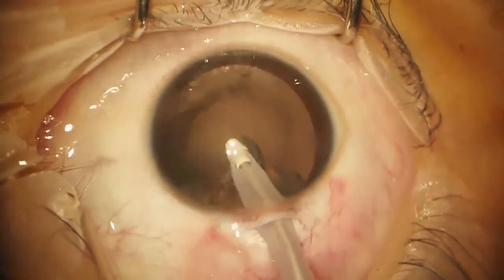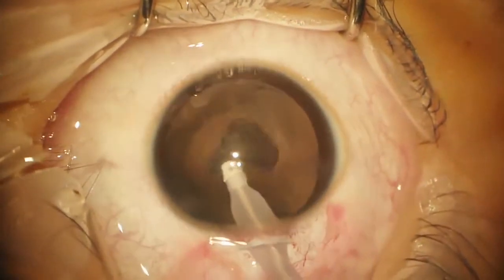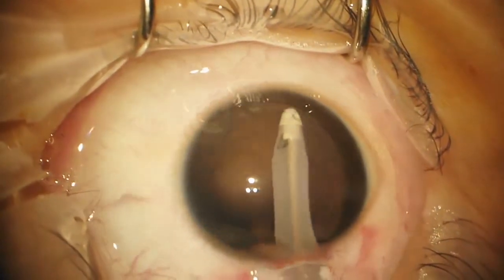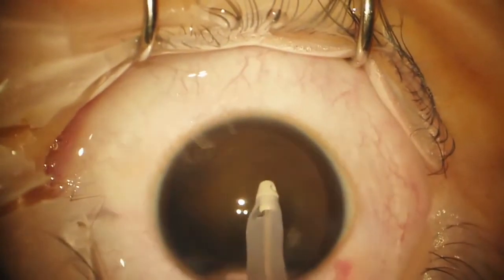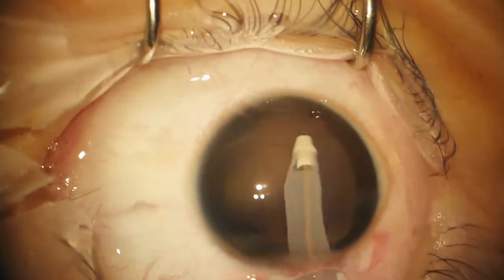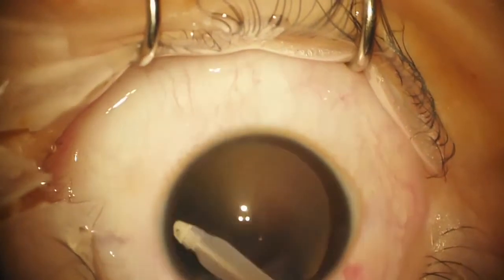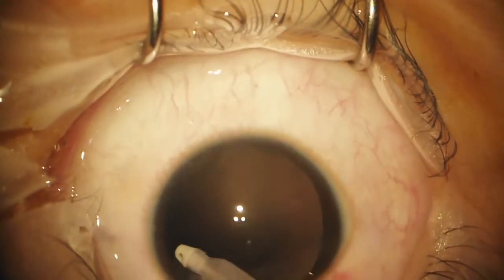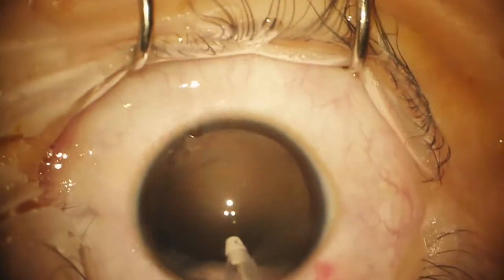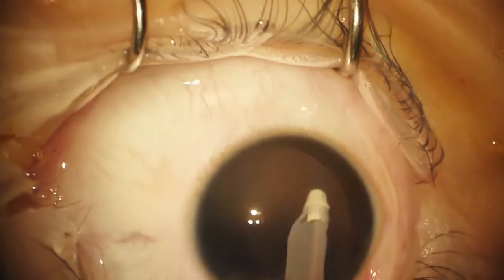I think coaxial works better in this case than bimanual, although bimanual is not a bad technique if there's residual cortex that needs to be removed under the incision. I will be very careful in polishing — probably one of those things you'd best just leave alone. I'm going to try and get as much of the opacity as possible, but you can see it's perfectly intact and very clear.